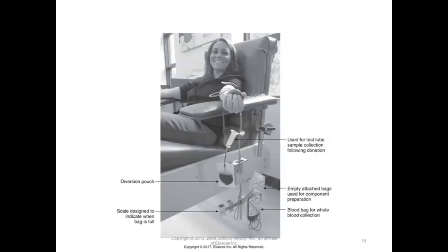So this is another type of scale where they set it on there and it's weighted to probably 475, 500 cc's.